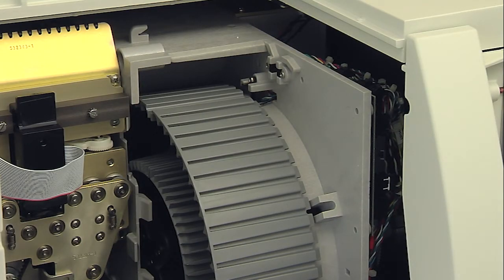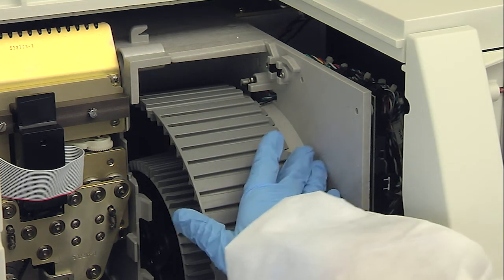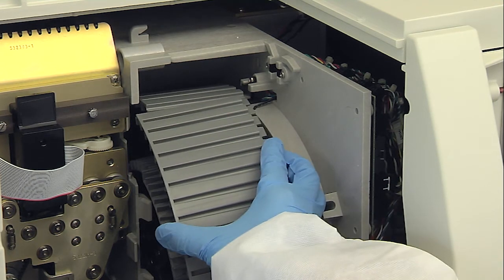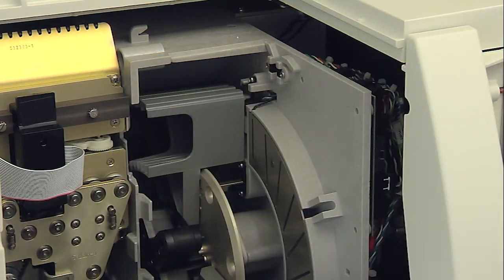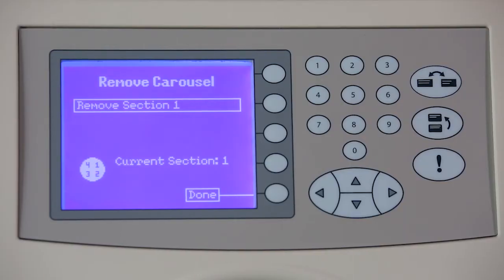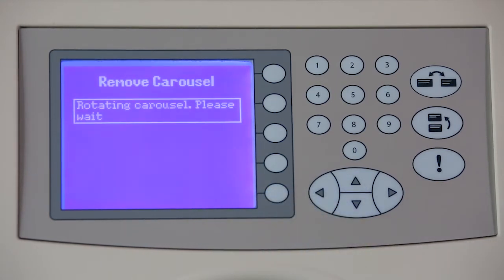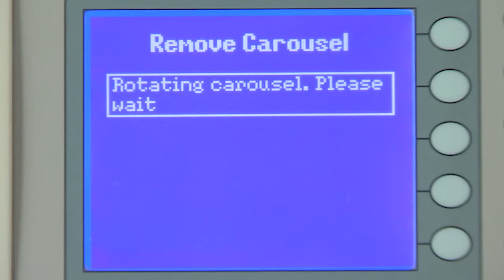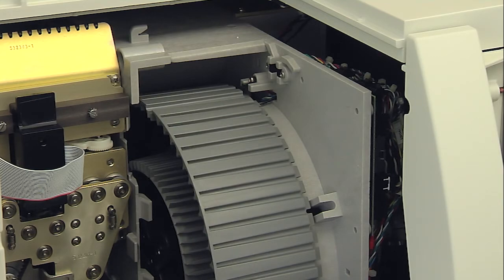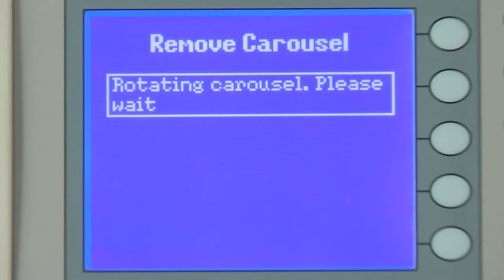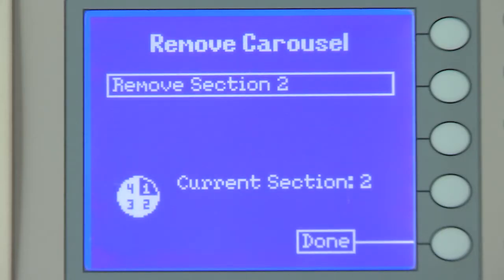The carousel is removed in four sections. Grasp the first carousel section and tilt it to the left, then pull the section up and away from the instrument. Next, press the corresponding function key to the right of Done. The screen displays the message Rotating Carousel, Please Wait, as the carousel turns and the instrument verifies the section was removed and positions the next section for removal.